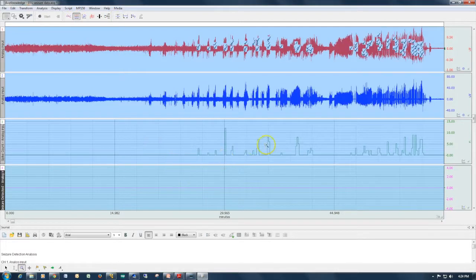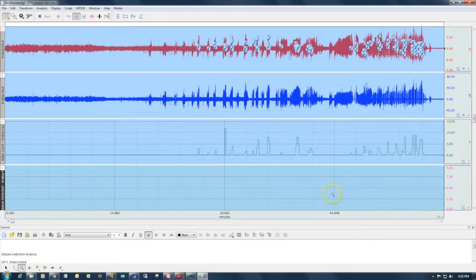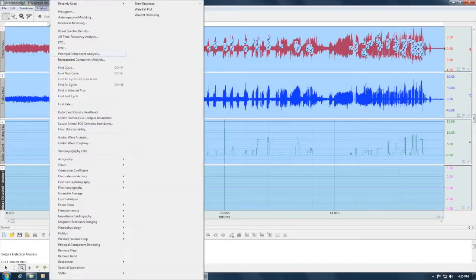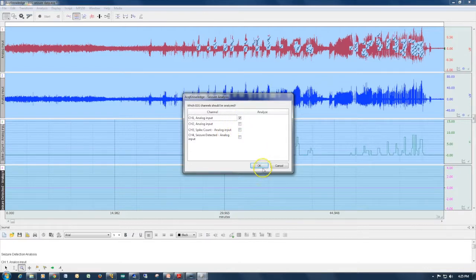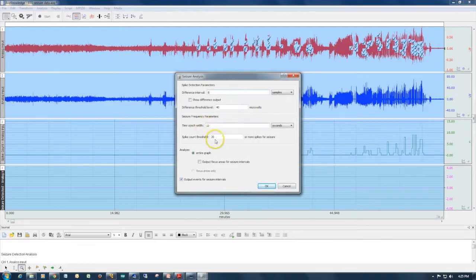If we compress our data back down, this new channel gives a count of the number of seizure spikes detected as you run from time zero out to the end of the file. The fourth channel is supposed to indicate when a seizure occurred or when a seizure met our classification criteria. As you can see, this is currently set to zero.